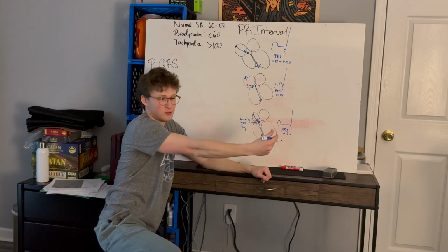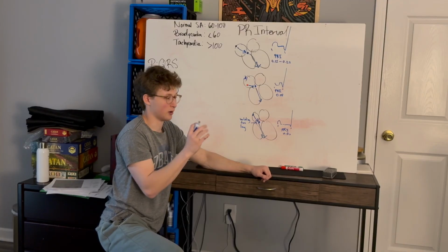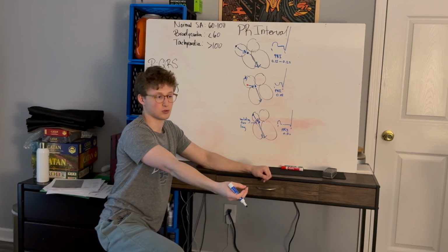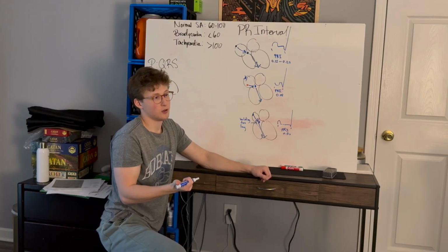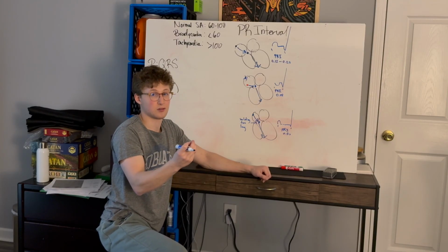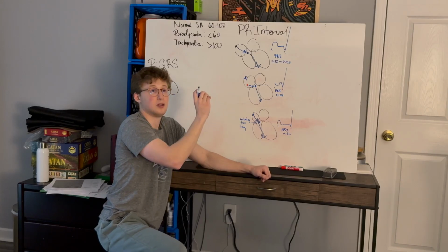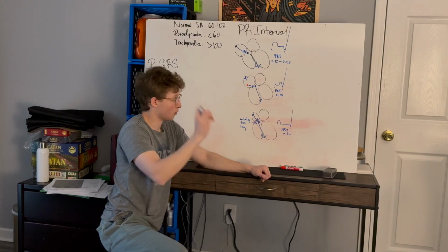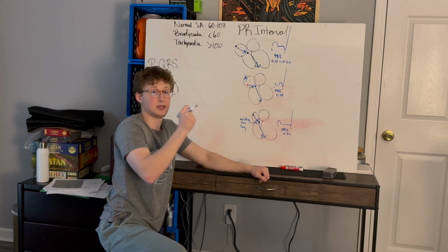And so when it lengthens, that tells us that the time between atrial depolarization, getting to the AV node and being released to the ventricles to start ventricular depolarization, is now longer. So somewhere in that chain of events, something is being blocked. And most often it's the AV node. Sometimes it's the SA node, but that will manifest in another area, not the PR interval. So usually it's the AV node. Something is holding up our signal from getting through. And that could be getting longer and longer.